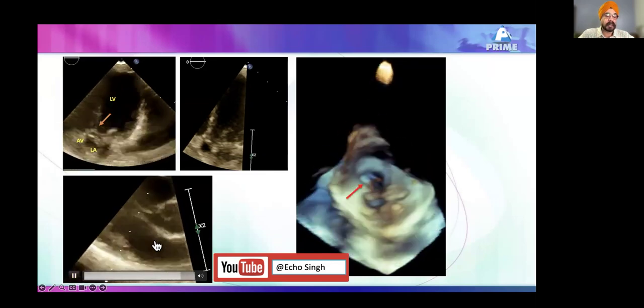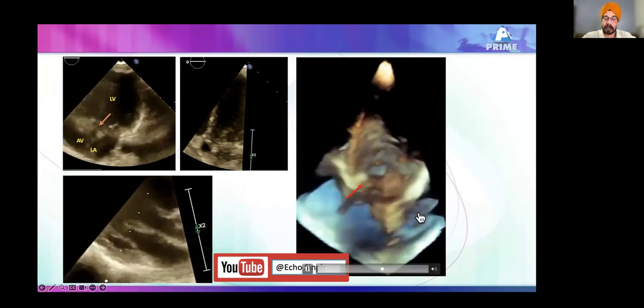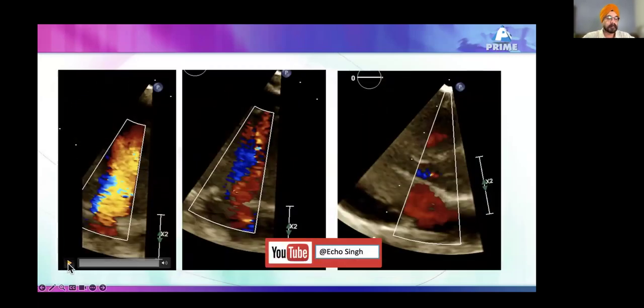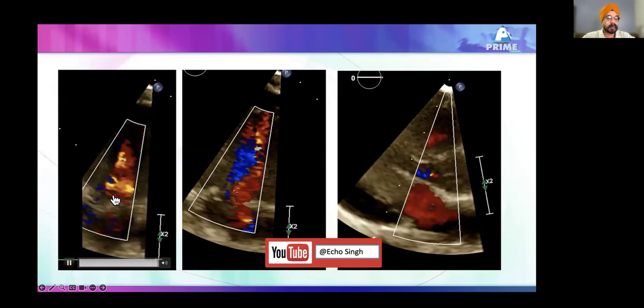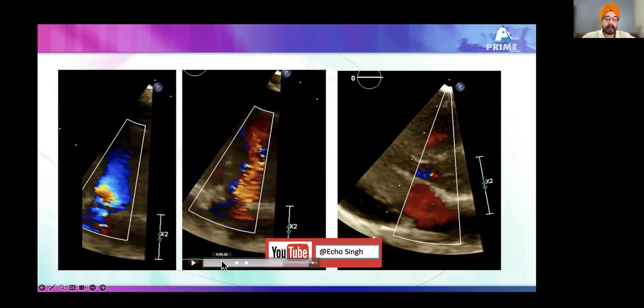on the 2D imaging, and you don't see anything on the parasternal long axis view. So this is where our formula really helps. Now you see this aortic, the PISA is happening quite proximal to the normal expected valve. And once you see on color Doppler here, there is usually regurgitation in most of the cases of subaortic membrane.